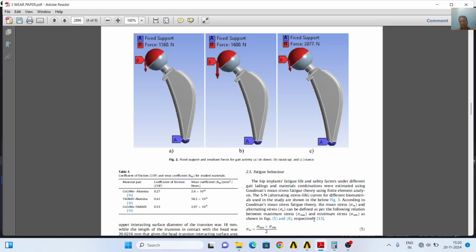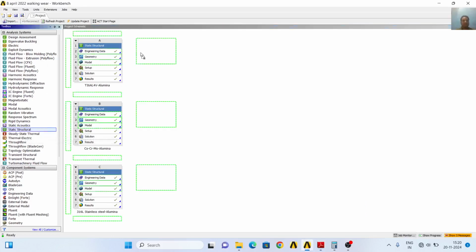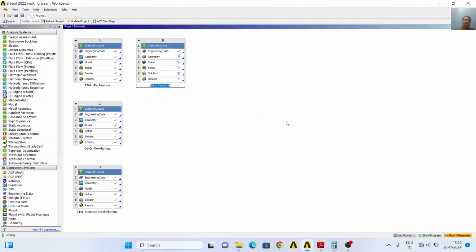So first we will go to Ansys Workbench, and I will create here a static structural module. There are already three files which I have prepared for the analysis, and we will copy this engineering data to this tab.